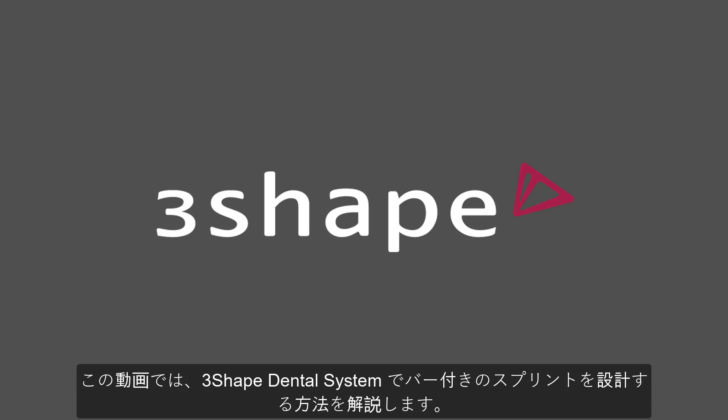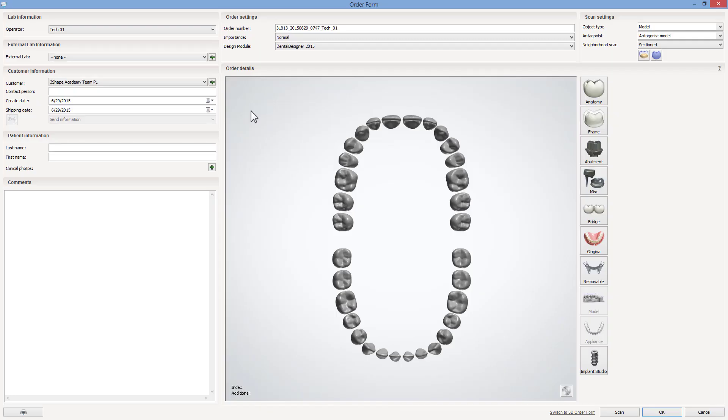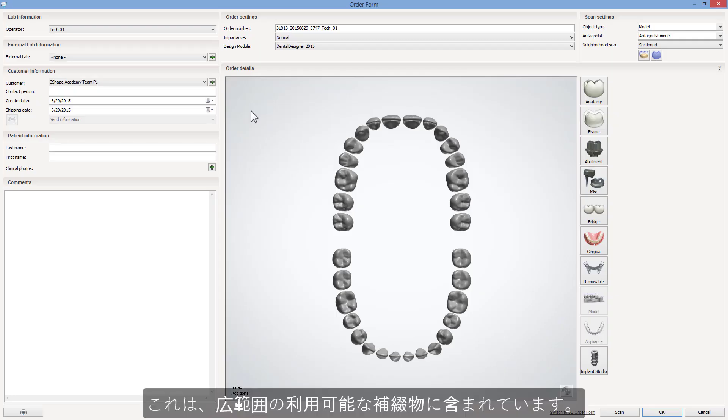In this video we are going to show you how to design a splint with bar using 3Shape dental system. This possibility has been now added to a wide range of available indications.